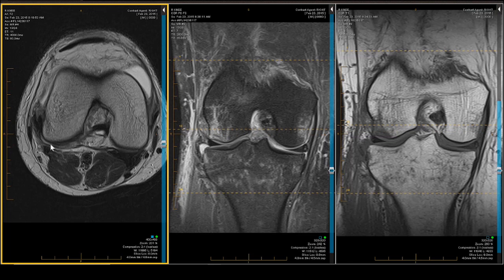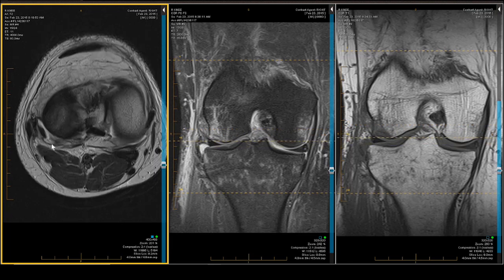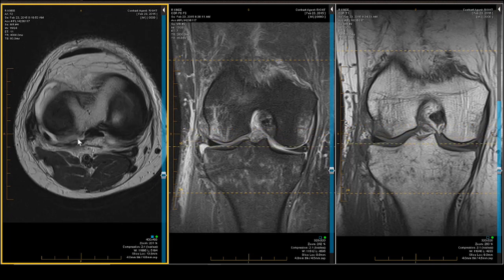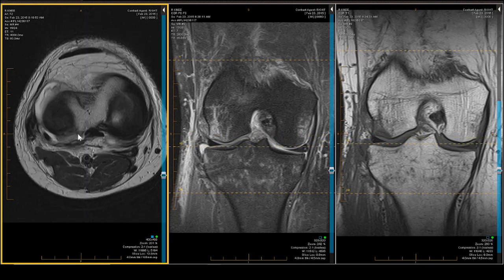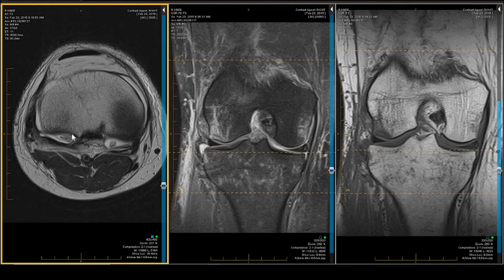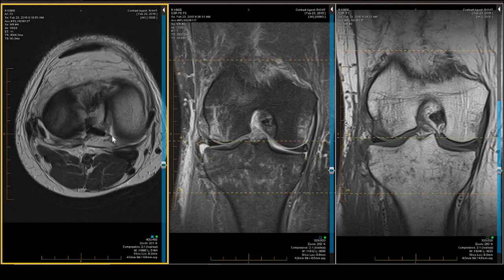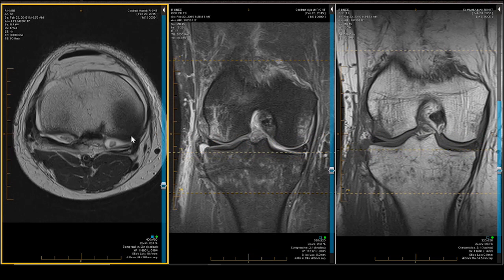Now let's go to the joint line on the lateral side. Things don't look quite right along the posterior bony margin — they look irregular, and if you're experienced you would assume there's a fracture present. On both the medial and lateral sides there are structures sitting posteriorly — those are either bone fragments or areas of coagulated blood. They happen to be bone fragments.